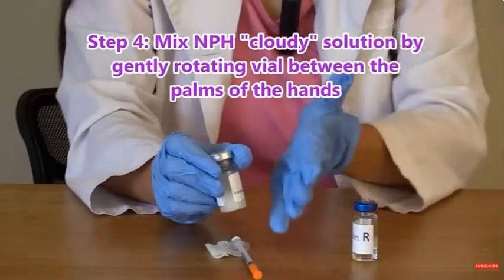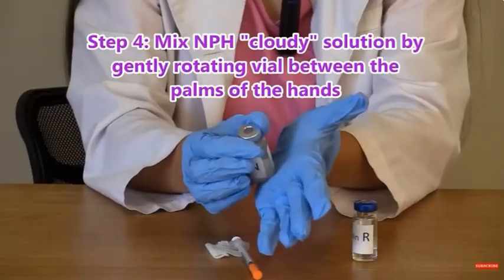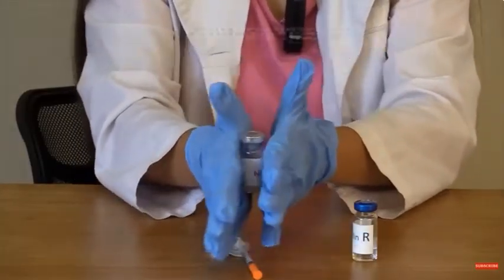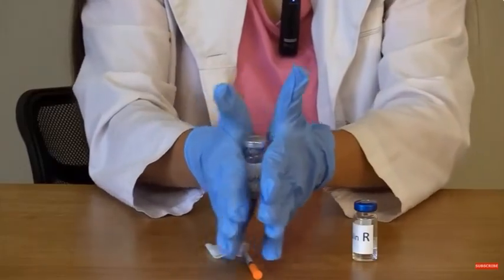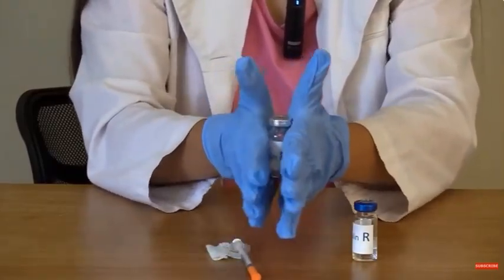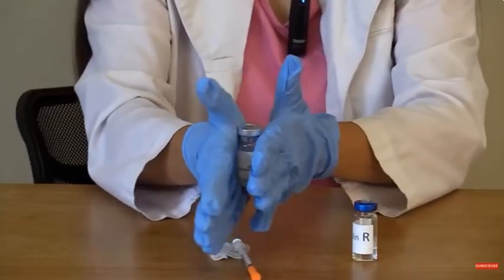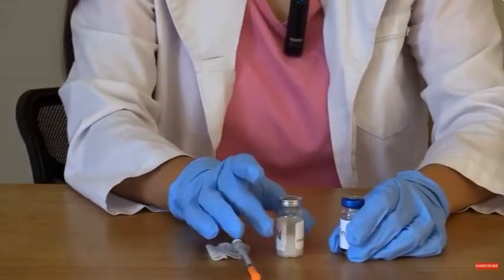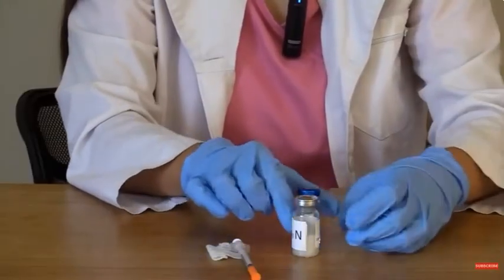To do that, you're just going to roll the insulin gently between the palms of your hands, because if you don't, it'll alter how much NPH you're actually drawing up. Make sure the solution is well mixed, and never shake it, because that causes air bubbles and can throw off how much NPH you will actually draw up.